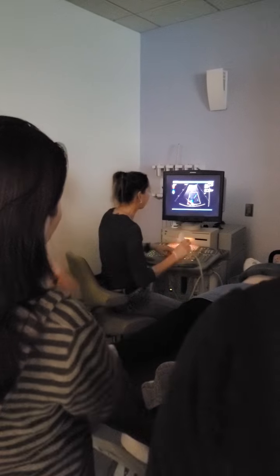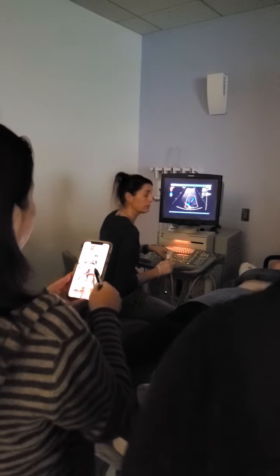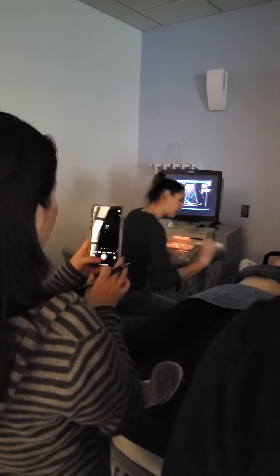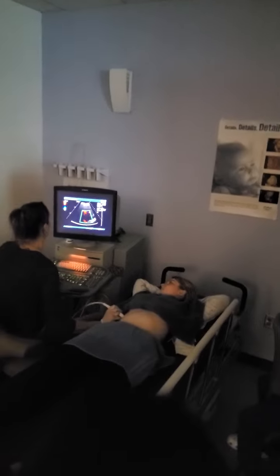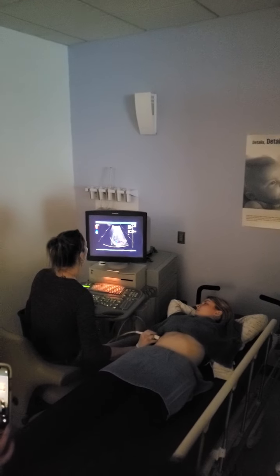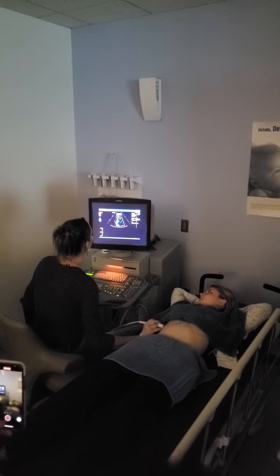But when we freeze this, we want to make sure that we're freezing it on a blue and not a red. And then, let's go back to our business. Okay, so we're angled. So here's our portal vein. We're angling up superiorly. Now, when we look at this, go ahead and hold your breath right where it's at.